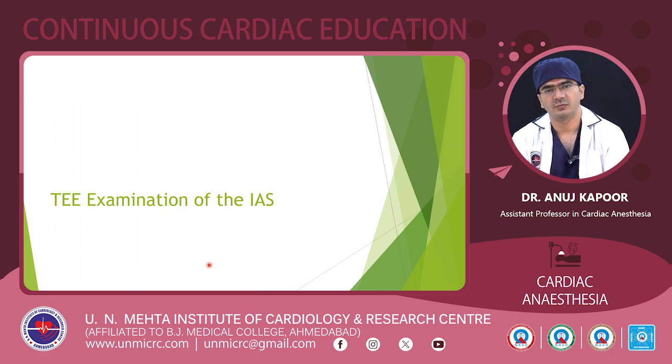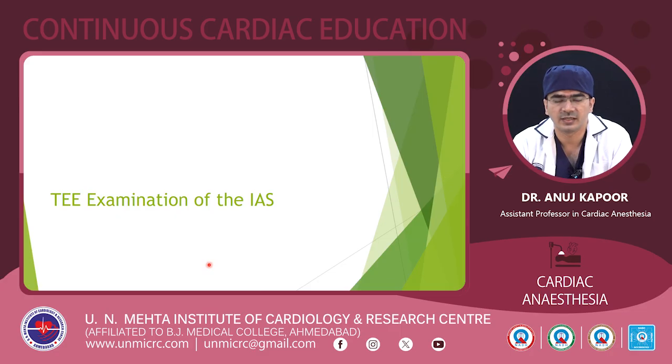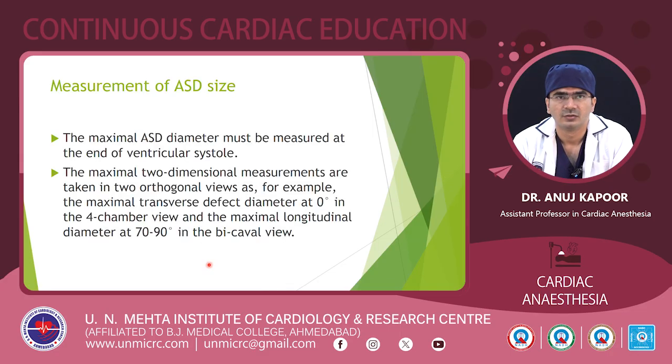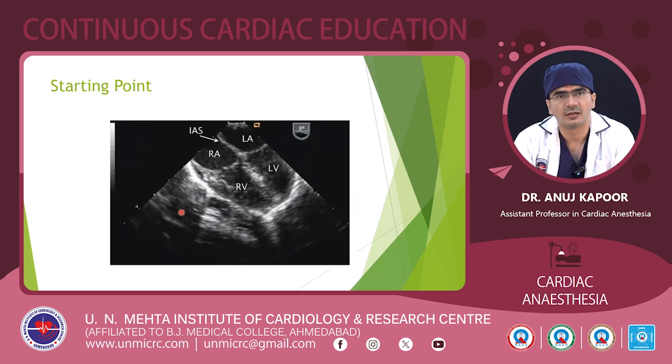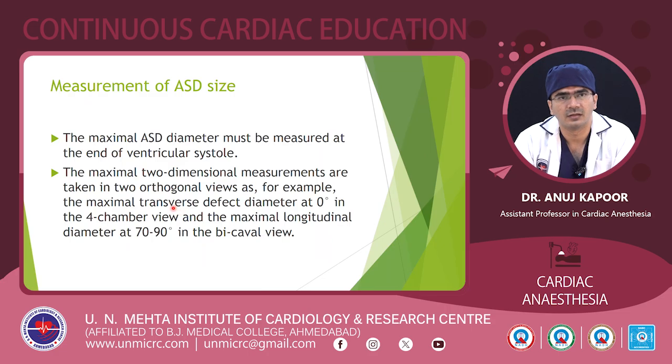So now we will progress towards the TEE examination for an interatrial septal defect. The basic place where we will start is measuring the diameters of the defect. The maximal 2-dimension sizes are taken in 2 orthogonal views. First of all, in a mid-esophageal 4-chamber view, we will get the transverse defect at 0 degree and the maximal longitudinal defect at 70 to 90 degree.